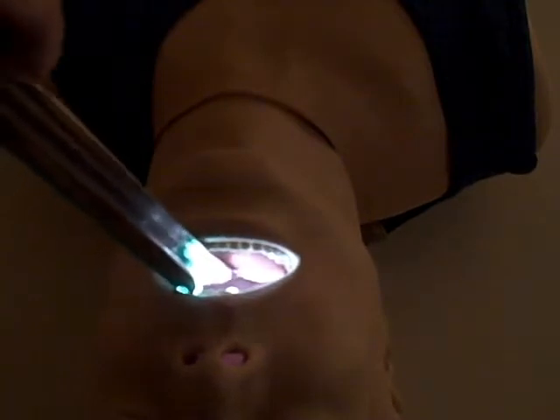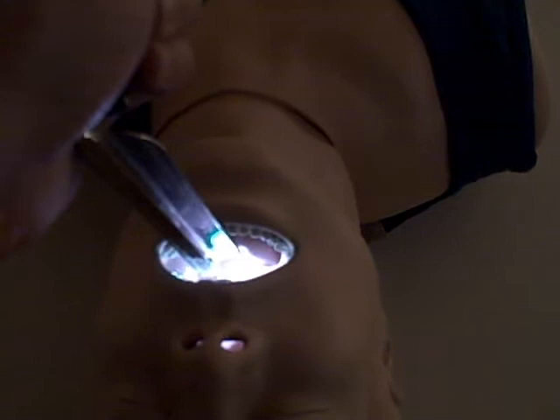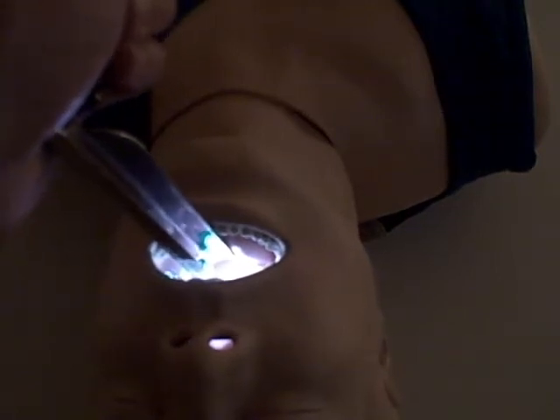This is the Truelight disposable laryngoscope. I just wanted to give you a sense for how bright this light is. It's an LED light on the end. This is a Miller blade. It's a nice white light helping you distinguish airway structures from potential airway obstructions.